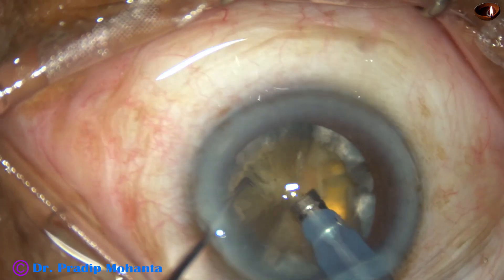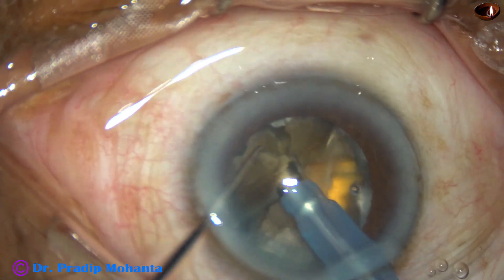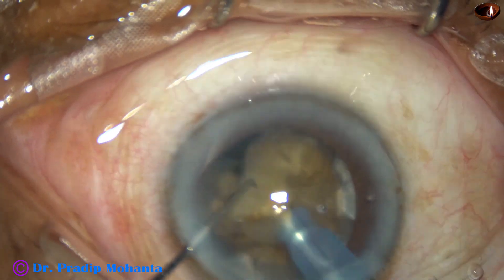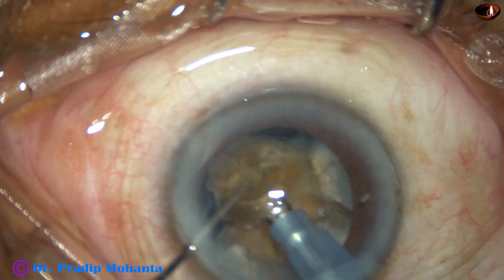My plan is to separate the pieces by applying ultrasonic energy at this point, and it got the pieces separated. See how leathery it is.